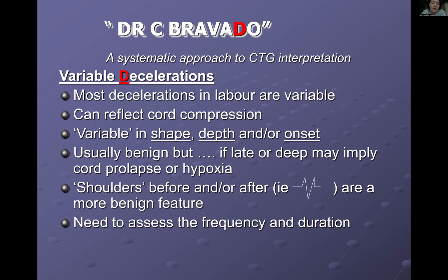However, if more of them start being late, right? So although they're variable and you get the occasional early one, if more of them start becoming late or deep, then that is significant because it might indicate that there is hypoxia or acidosis.